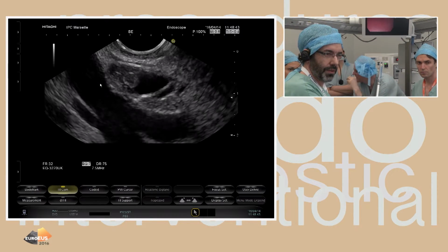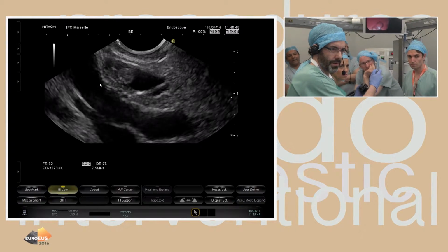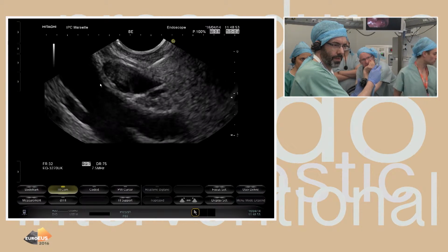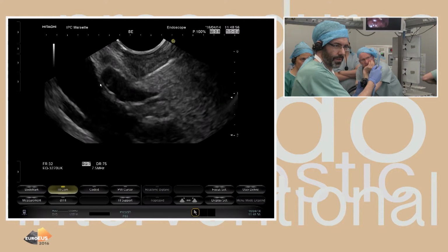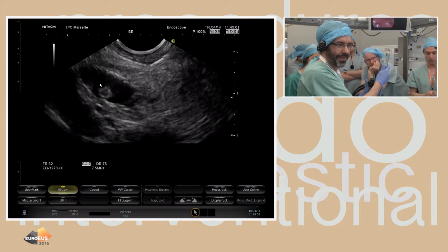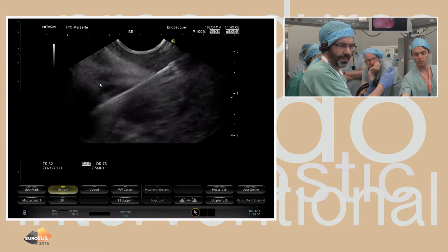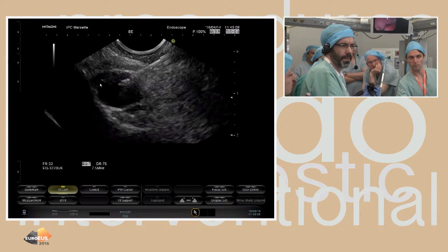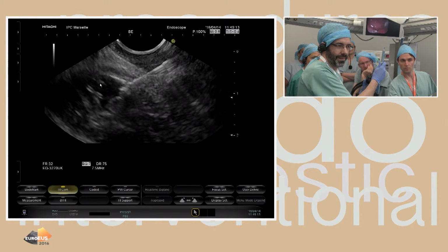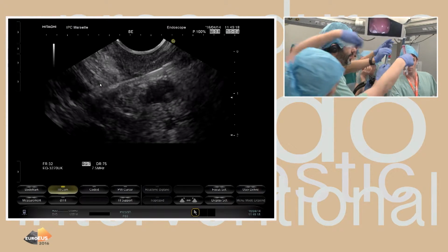Yes, but when we give the contrast, it was not. It's quite hard. Okay. Yeah, he moved. He's moving. You have a nice, very nice. This is the kebab technique, hein? There's a brochette.